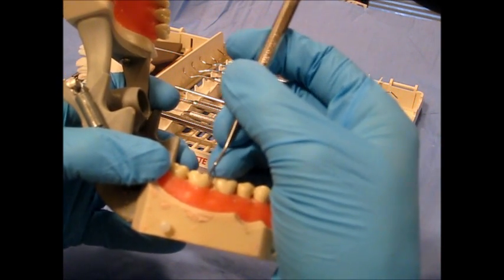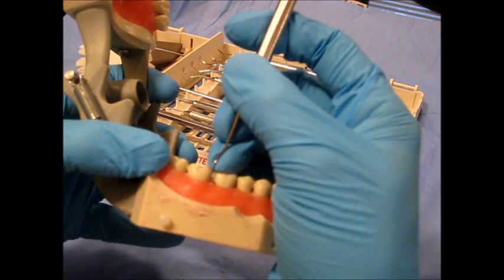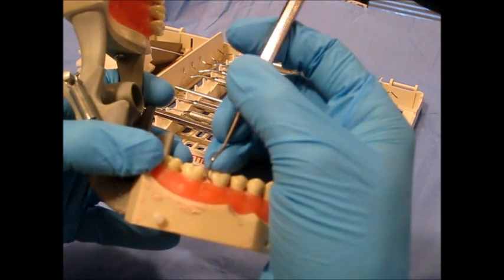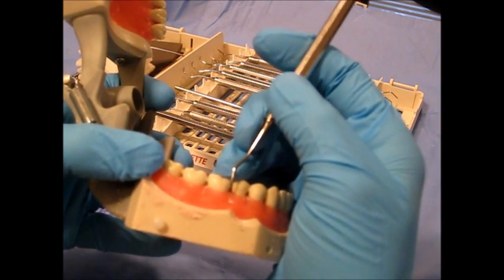And then, we come out and rotate and use it from the distal line angle to the mesial interproximal space.